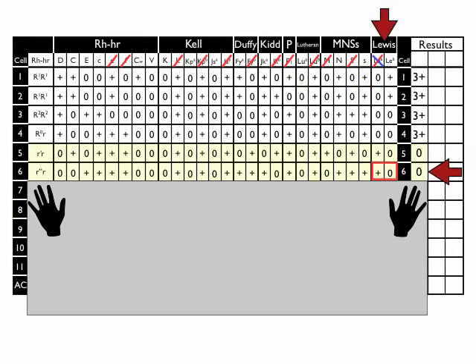I will tell you that some people, once they have a single double dose rule out, won't put any more slashes, and it actually will save them time looking at the panel. Little trick for examinations, I always do that on examinations, and in some cases I do it in real life as well. But the way that I was taught and the way I'm showing you on this particular panel is to try and get at least two double dose rule outs before you stop doing your slashes. Okay, so let's move on to the next pair, which is big S and little s again.